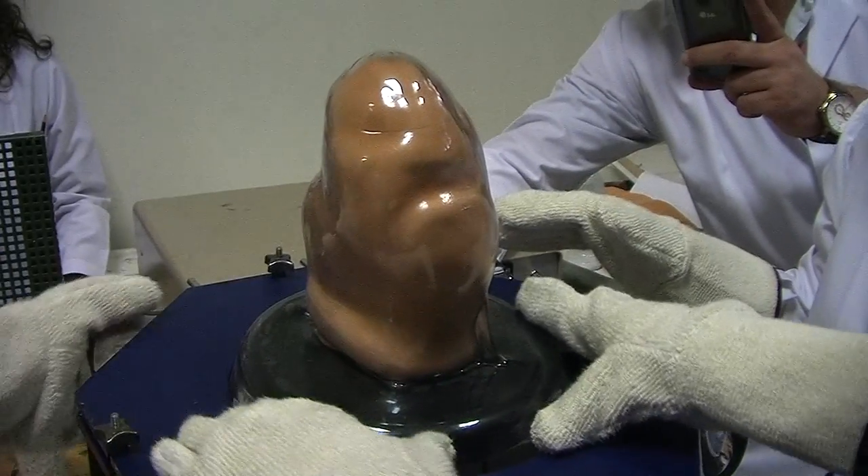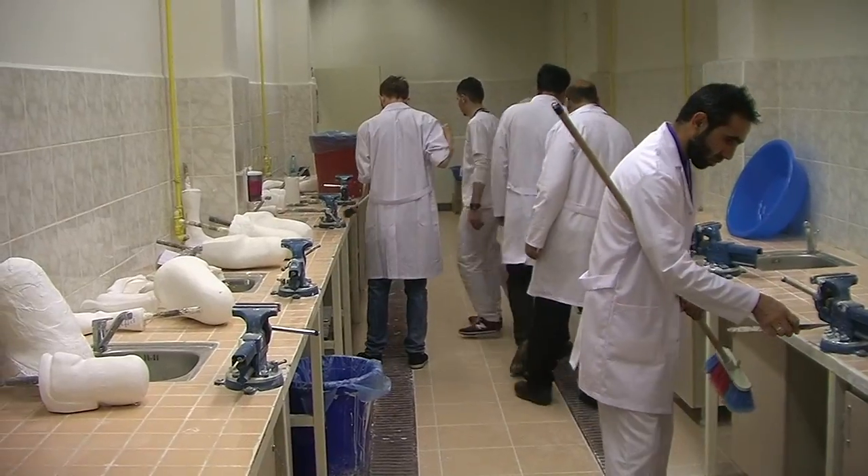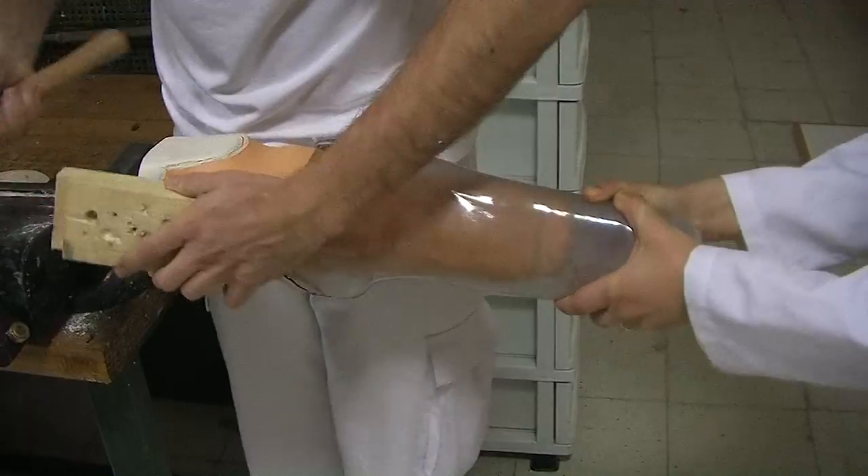We have to get a soft inner socket. I can take care of this.